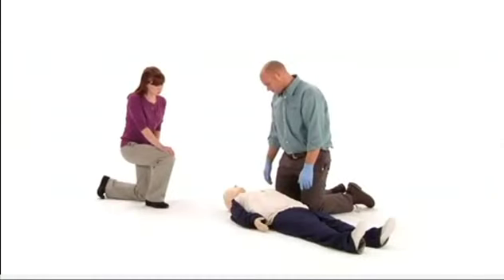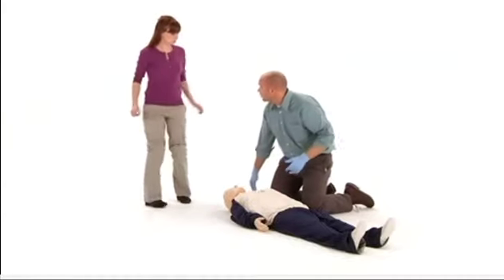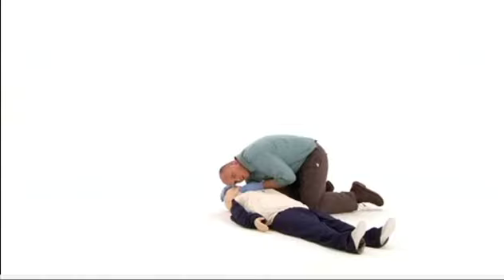Every year, thousands of people die of sudden cardiac arrest. "He's unconscious. Go to the front desk, call 911 and bring me the AED." Following the links of the cardiac chain of survival can help save lives. The sooner 911 is called, the sooner advanced medical care will arrive.